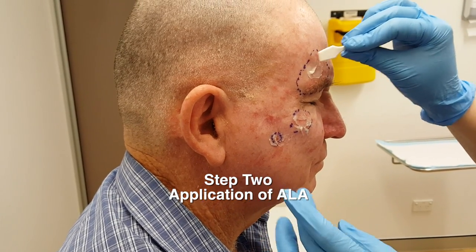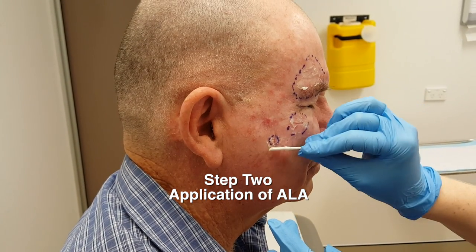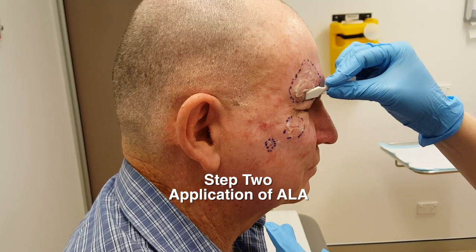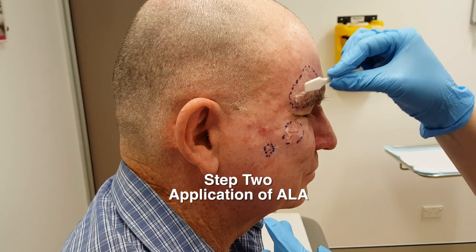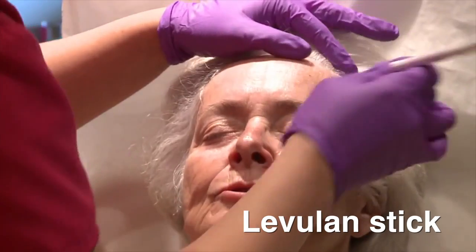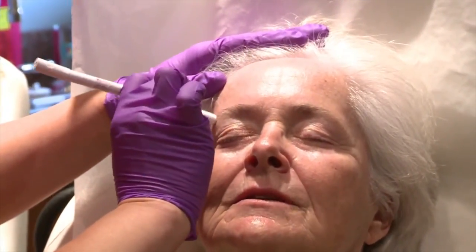Step 2 is application of the cream. Here in Australia we use our old-fashioned spatula technique using Metvix ALA. We apply it on thickly, but in the US you're much more sophisticated — you've got a stick called Luvan.